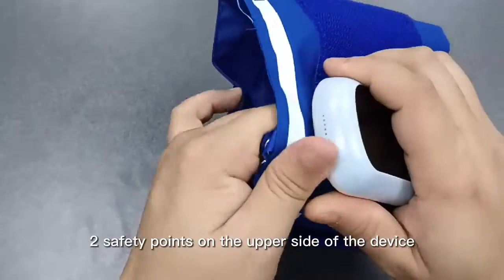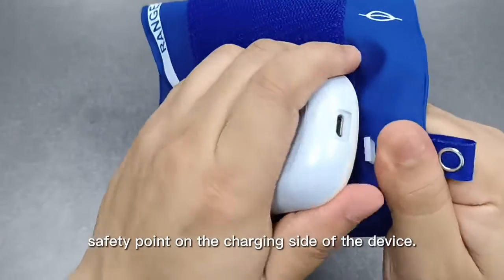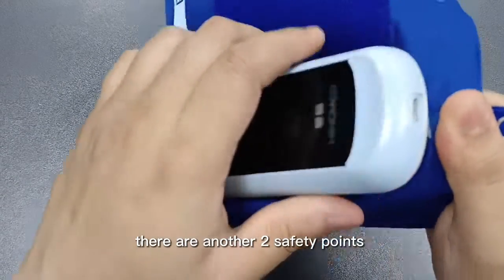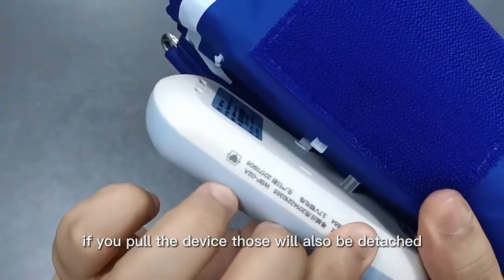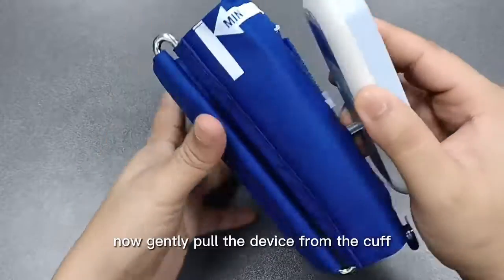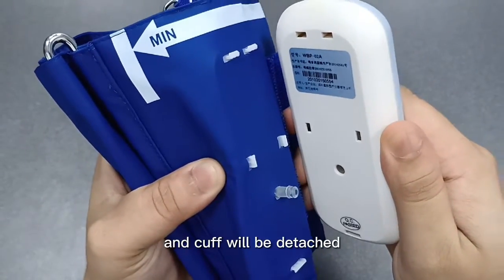First, detach the 2 safety points on the upper side of the device. Then detach 1 safety point on the charging side of the device. There are another 2 safety points in the middle of the device — if you pull the device those will also be detached. Now gently pull the device from the cuff, and the tube that connects the device and cuff will be detached.